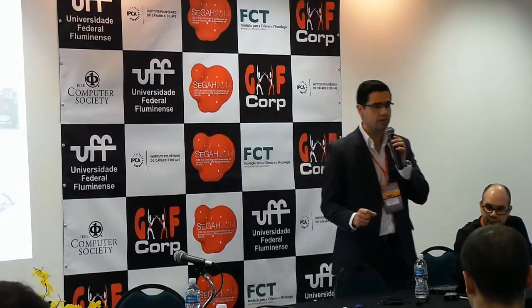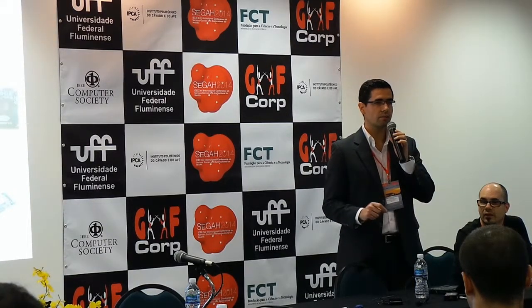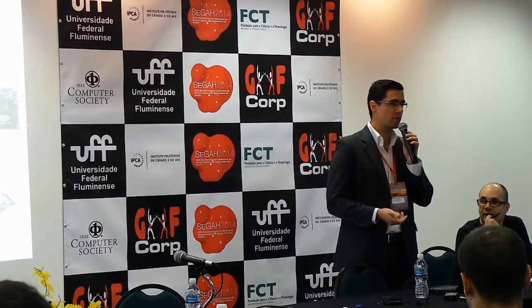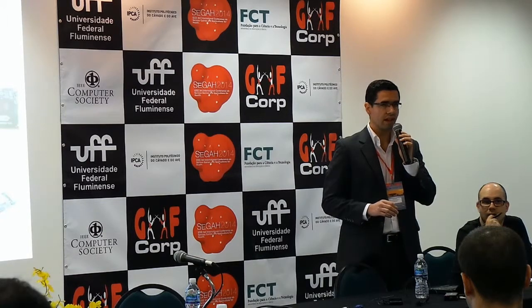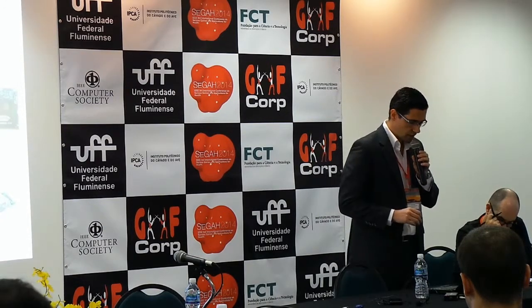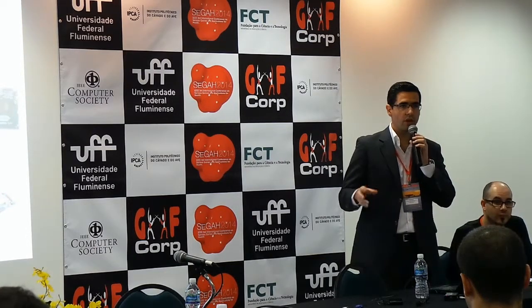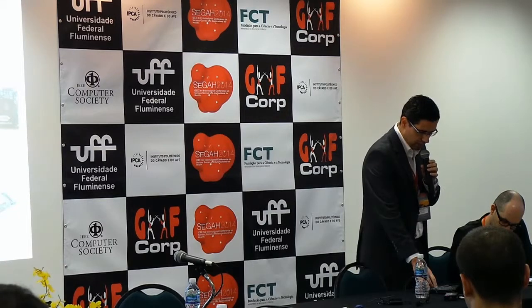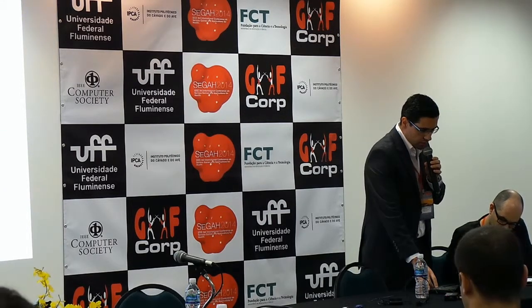It has a very differentiating characteristic, which is it is able to detect specific features of the signal that might be of interest for your application. In this case, we will talk today about epilepsy detection on this platform. And also the power consumption is very important. So we are also addressing this and trying to make this platform as low power as possible.